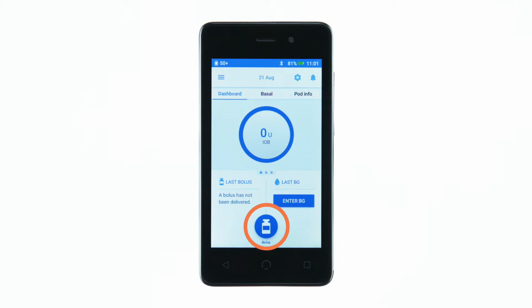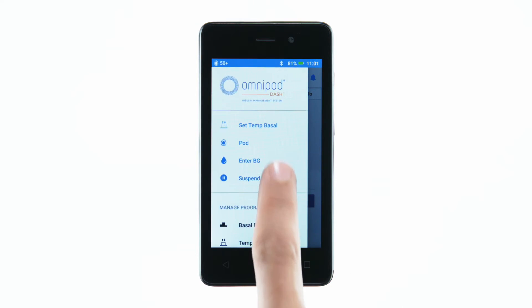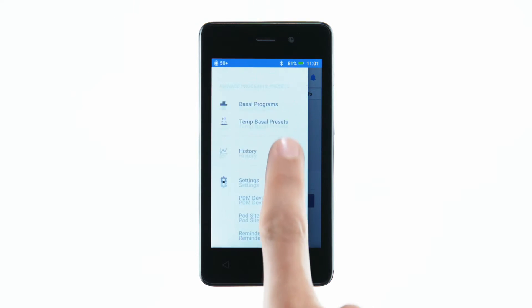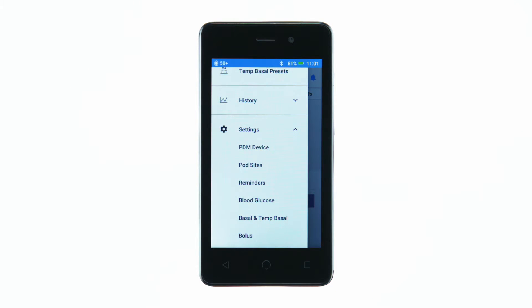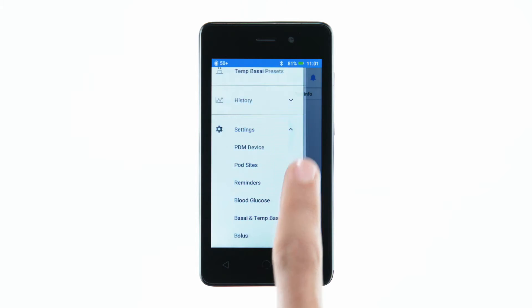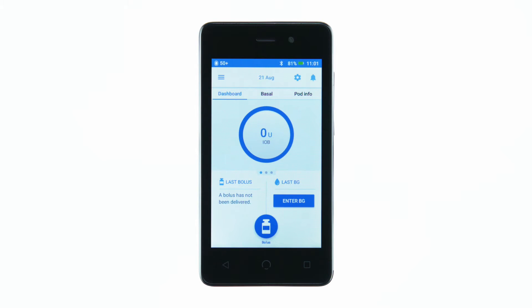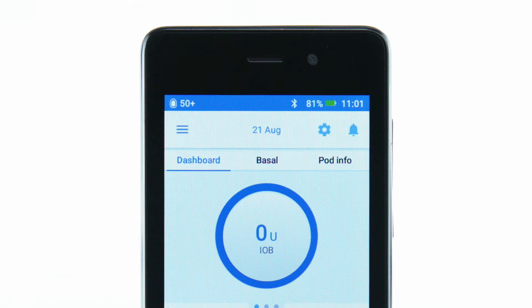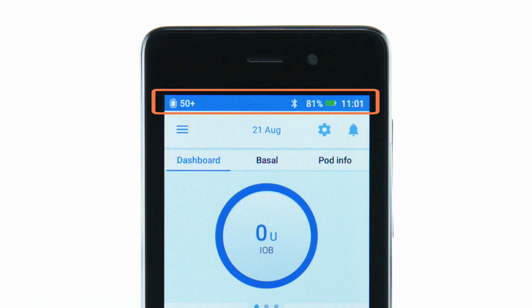Accessible from any home screen view is the bolus button at the bottom of the screen. To access more settings, tap the menu icon on the upper left side of the screen. The status bar at the top of the screen will display information about the volume of insulin in your pod, as well as your PDM's battery charge.